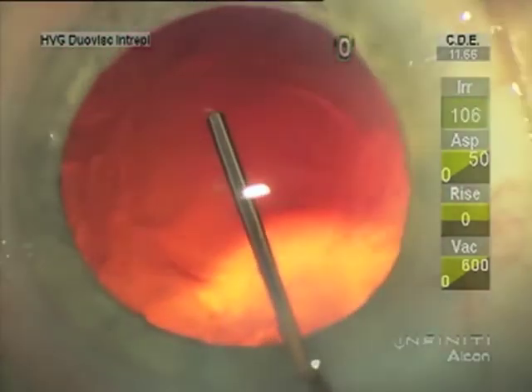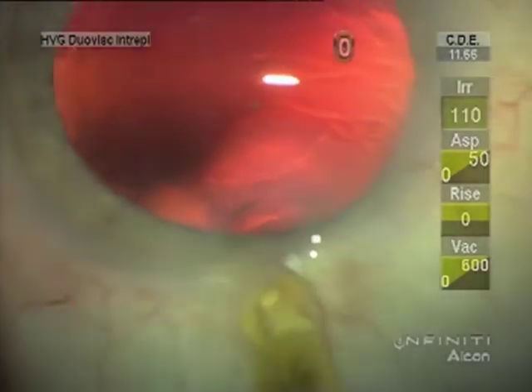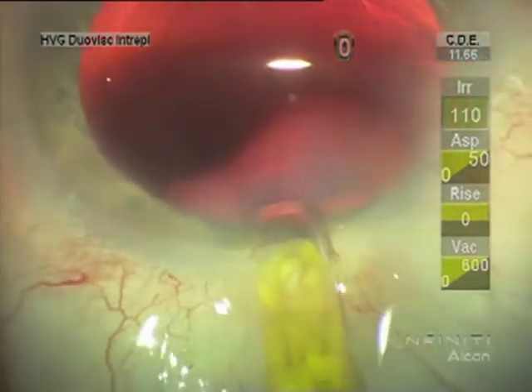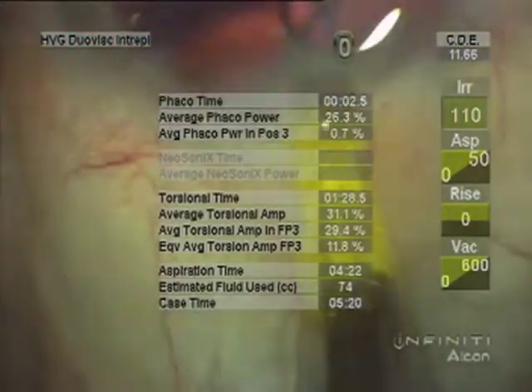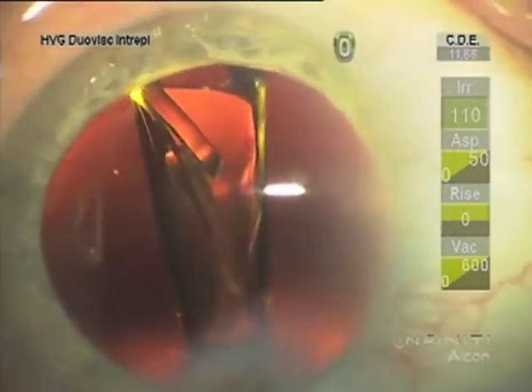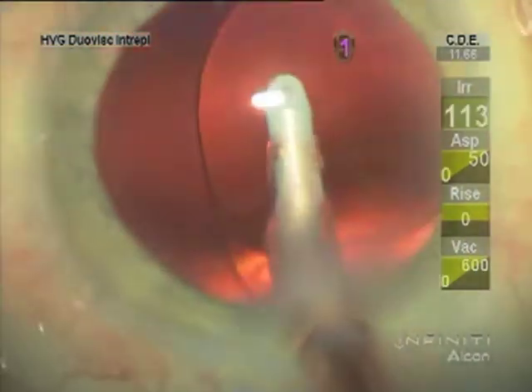I then inject the Provisc into the bag and make sure that the posterior leaf of the capsule is well separated. When I start the injection I have the patient look toward the injector for counter pressure. Once the lens is about halfway in I have them look straight ahead again, then keep going with the plunger until I can manipulate the lens with the plunger instead of a second instrument.